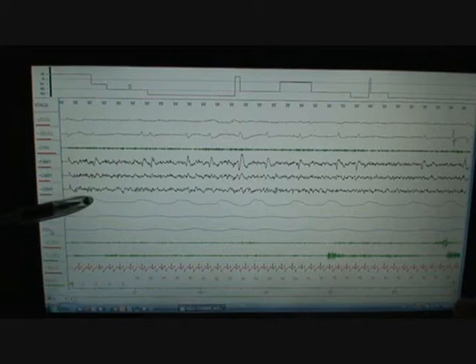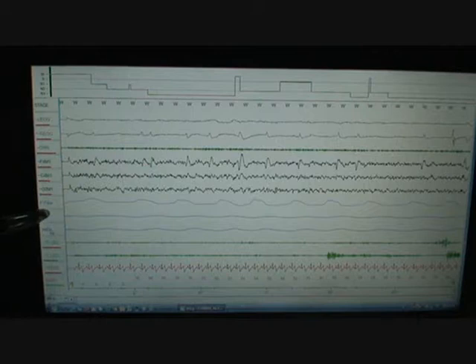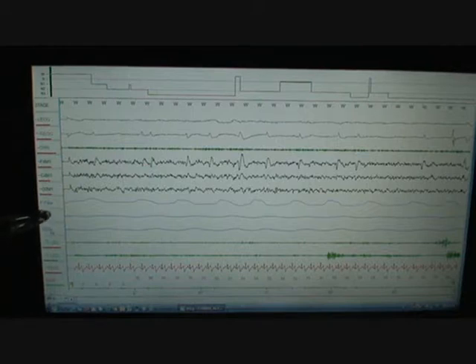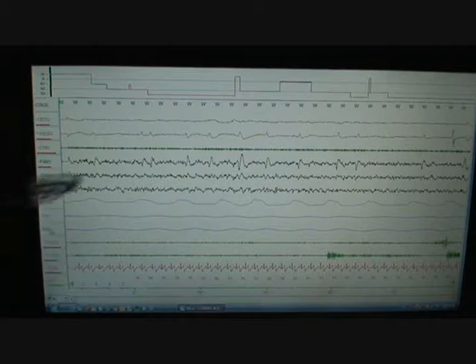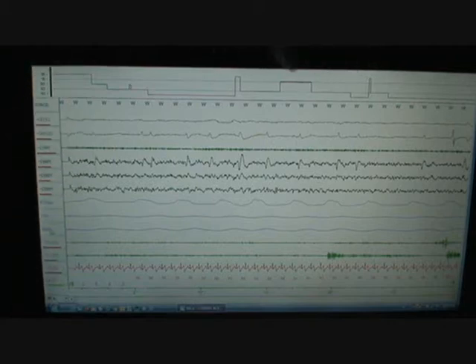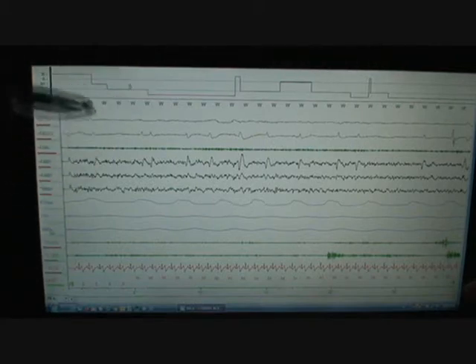This is the airflow, the breathing. Thoracic is the belt around your chest. Abdominal is a belt around your stomach. Then you have the right leg, left leg, EKG for the heart, and then the blood oxygen levels. Up here at the very top is a hypnogram. It just kind of shows what the stages are as we're going.